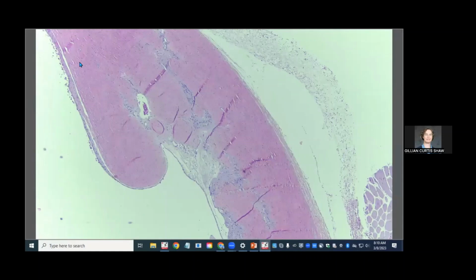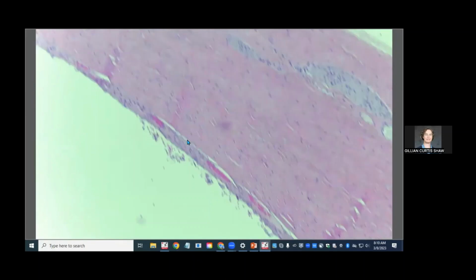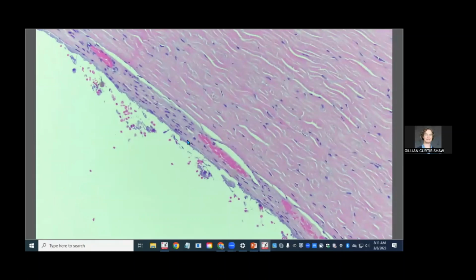And we're still going back, and finally right back here, we pick up something that maybe is choroid. In blue eyes like this that have a very, very poorly pigmented fundus, the choroid is normally very, very thin and actually almost difficult to discern in a normal non-colobomatous eye. But in this case, I think this is actually the choroid here, so it has picked up. So basically we had a ciliary body and perhaps peripheral choroid coloboma up at the front there.